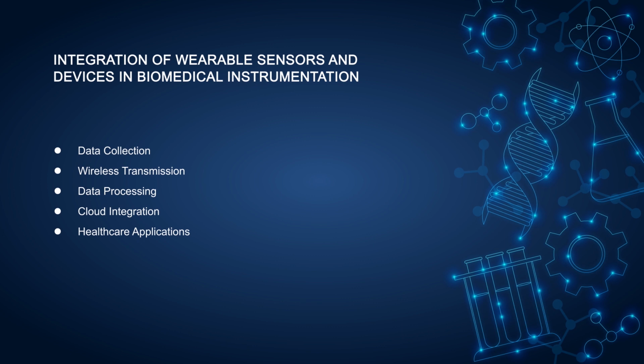The last one is healthcare application. Processed data can be integrated into electronic health records systems, medical dashboards or mobile applications for medical professionals and patients to access and monitor. Now, while the integration of wearable sensors into healthcare systems holds immense potential, there are challenges that need to be addressed.